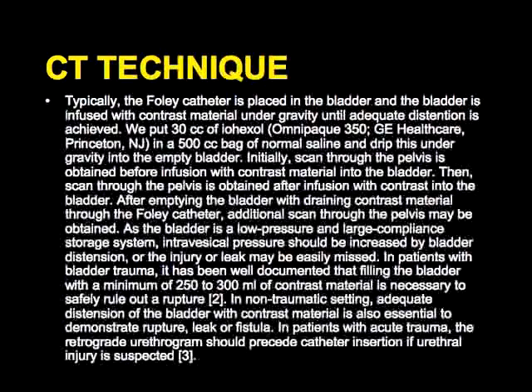What we'll typically do is we'll then initially scan the patient without any contrast in the bladder, scan them at maximum distension, and then drain the bladder and rescan the patient. Some things show best, sometimes small perforations on the delayed scans, but most of the time it's that image with the bladder well distended that shows you the fistula and shows you very nicely any perforation or extravasation. In terms of minimum and maximum, I guess I'd be concerned about theoretically perforating the bladder, but with gravity it makes life simple, and typically you'll get in 300 or 400 cc's, and that indeed works very nicely. So it's a very easy protocol to use.